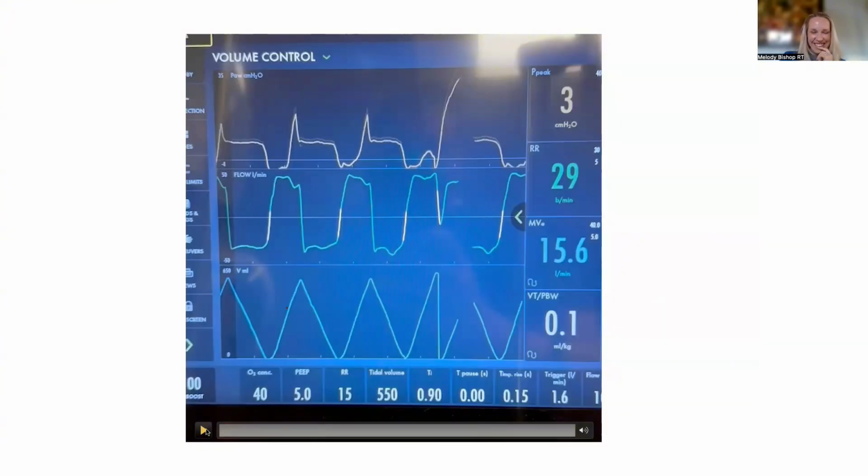But we're going over some waveforms. Some of them are pictures, some of them are video. This one is a video. I believe this one is mine. I believe, meaning I took it. I'm trying to see if you can see me there. Maybe not. All right, so let's hit play.